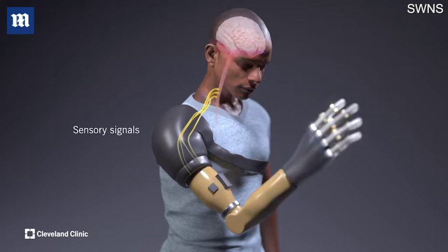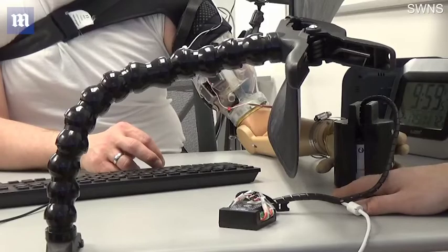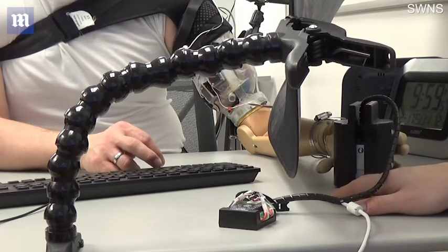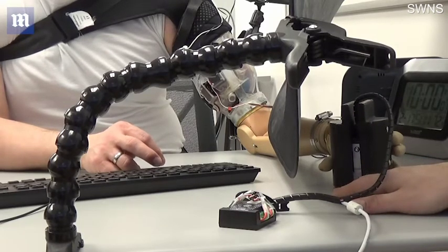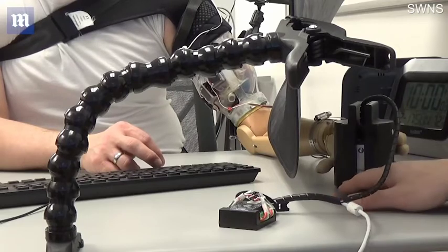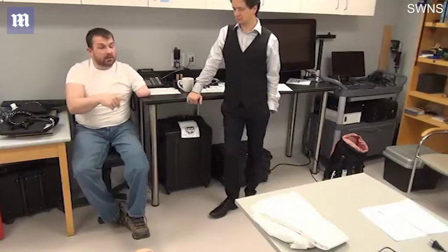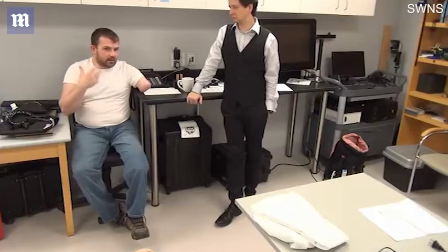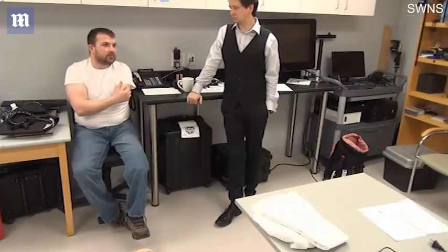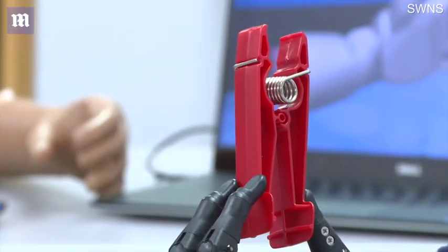For the most part, when you buzz my arm and the hand moves, that is almost the same as what I think when I go to close the hand. So if I have the arm on and I'm running things, that whole vibration feedback — I don't notice it because I've already initiated that movement. I'm making it do that, so I don't really notice the vibration.